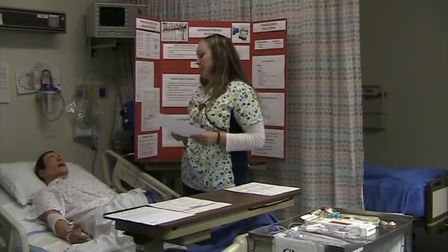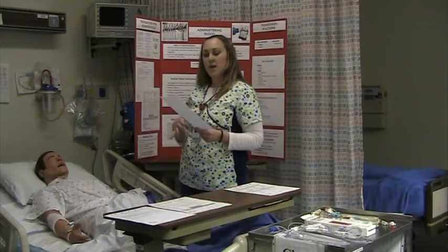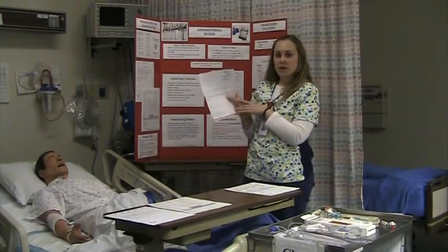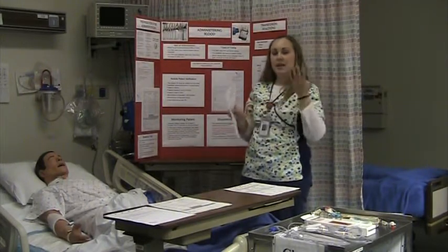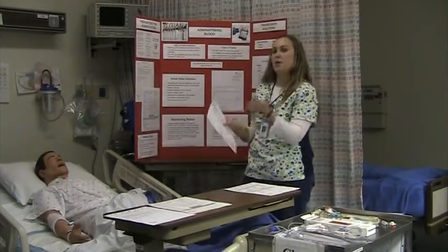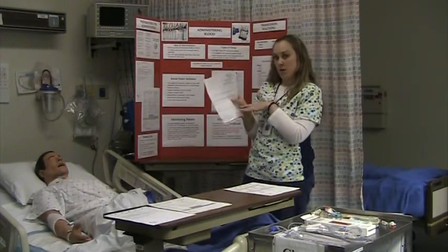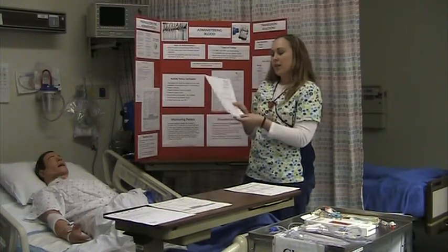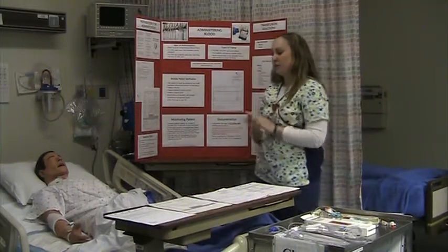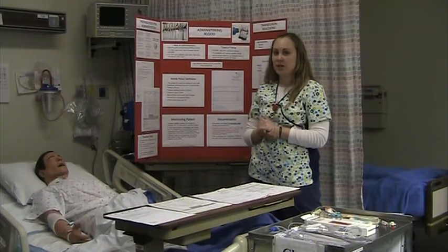Vital signs are stable. This is Rico Suave, med rec number, such and such, date of birth. You go through your whole spiel. Both nurses need to look at the blood flow sheet, and the blood, and the ID of the patient. It's really important that both nurses are looking at both the blood bag and the list of the blood order and the ID band. Then once we have that all co-signed and started, we stay with the patient the first 15 minutes. If there's a reaction that's going to occur, it's going to occur in the first 15 minutes.